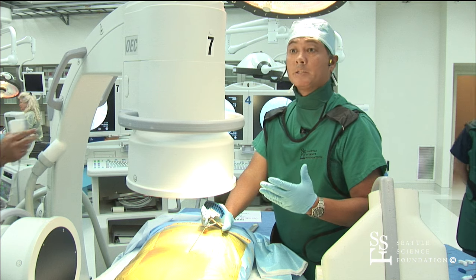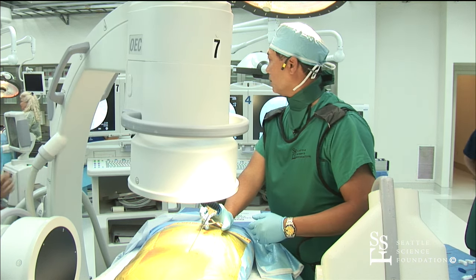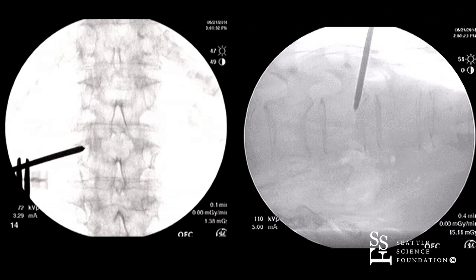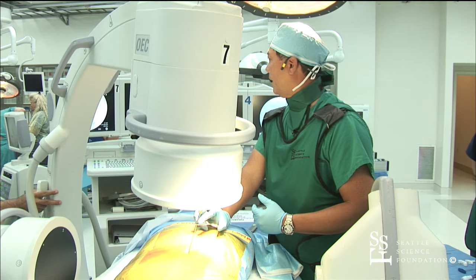We're going to be displaying today a transpedicular approach. A little more cranial tilt. I'm identifying right now the pedicle.